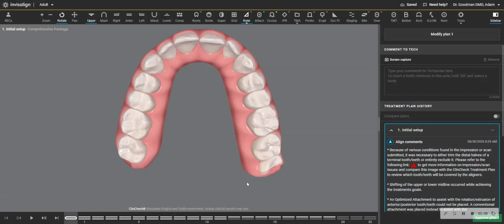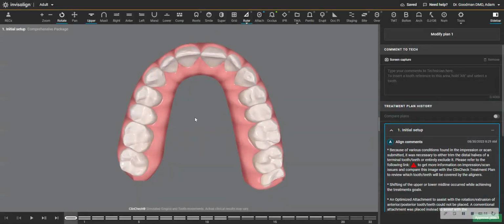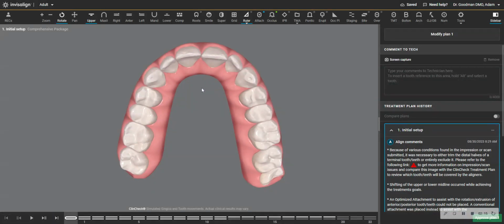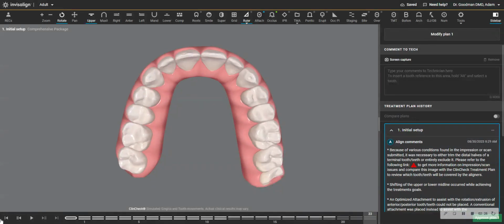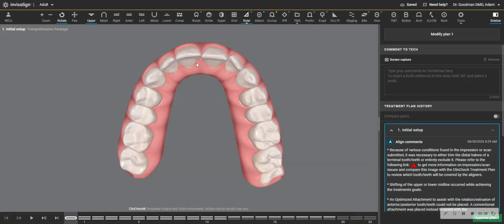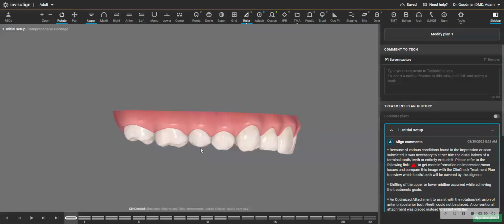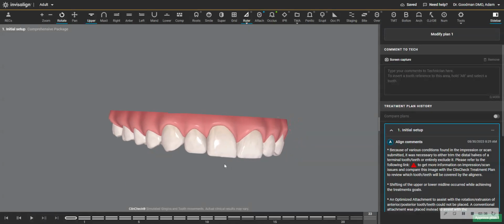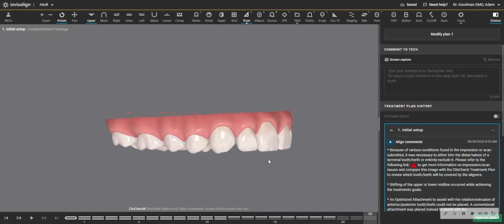But this is not a realistic movement, because what you have to look for and recognize is the leading edge of this tooth movement on the upper anteriors here is the palatal. Look at how the gingival margin on the palatal is moving more than the incisal edge. And you can check that also looking at it here in this view, and you'll see that the gingival margin from the buccal is going in more than the incisal edge. This is called lingual root torque.